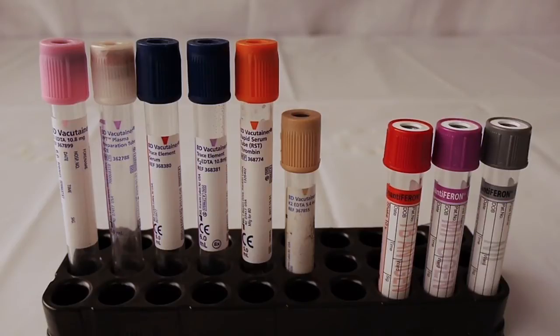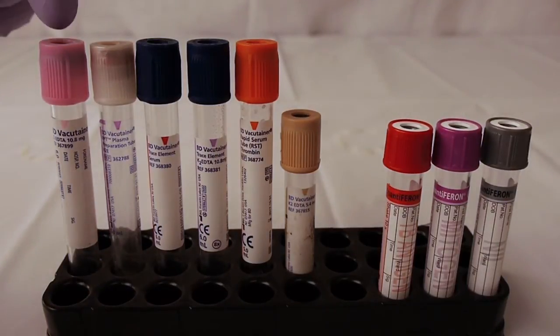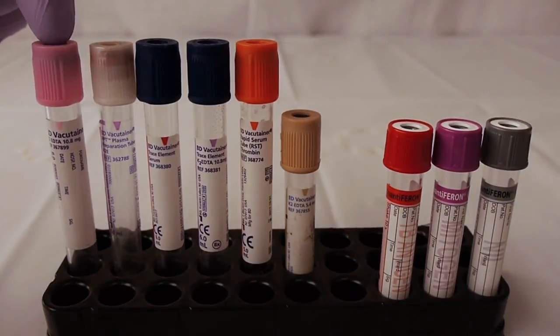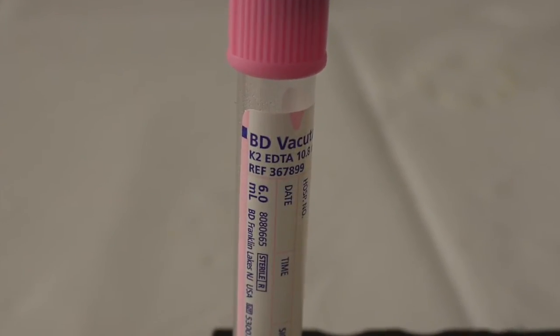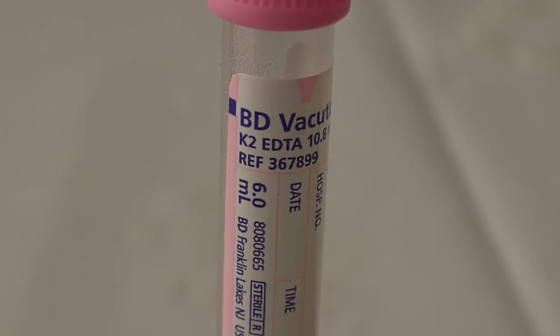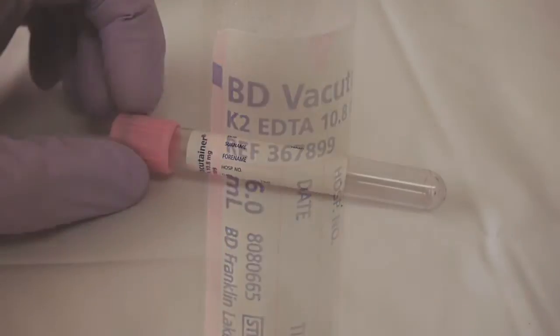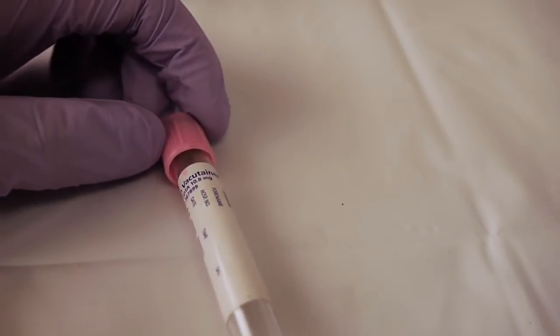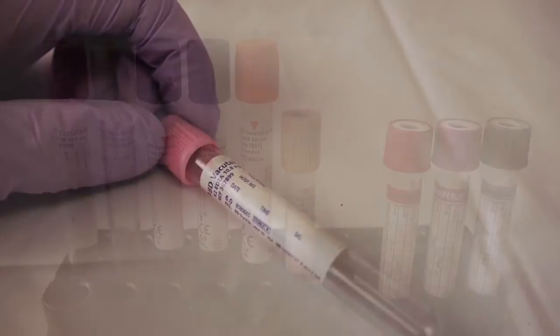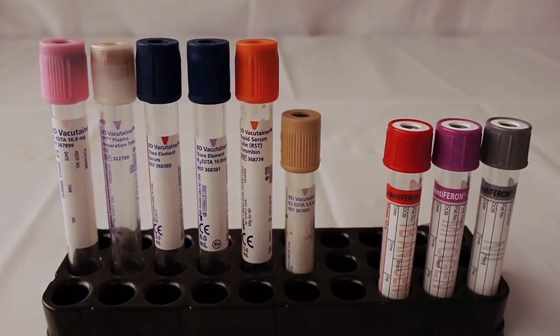Let's start on the far left. We have the pink top tube. The pink top tube is considered a blood banking tube, blood banking or immunohematology. This tube has EDTA, but it has a label that's designed to meet blood banking standards.